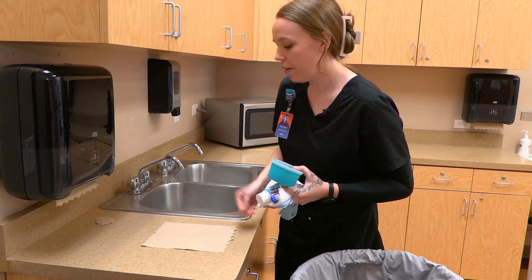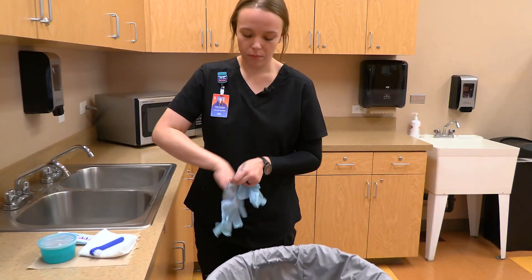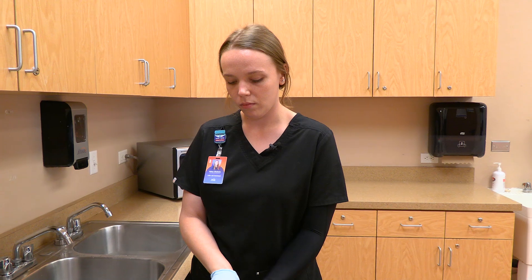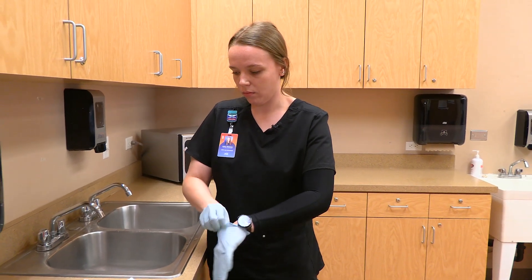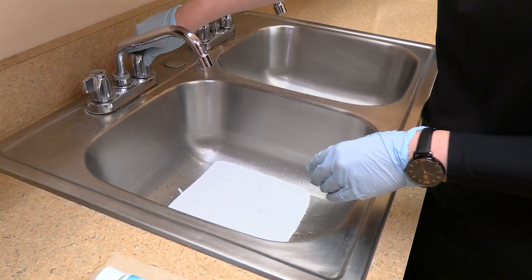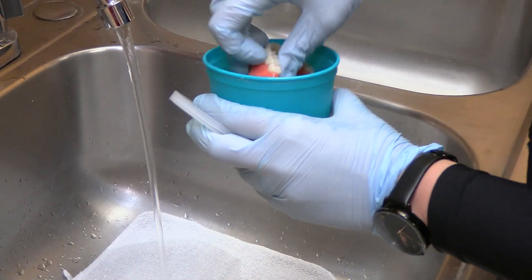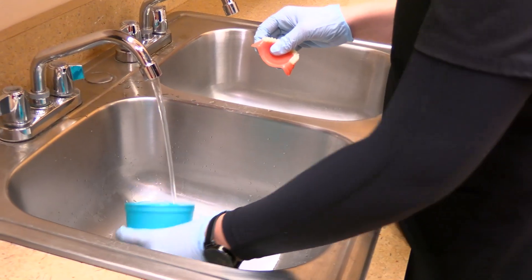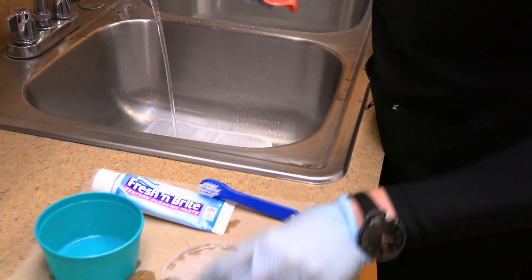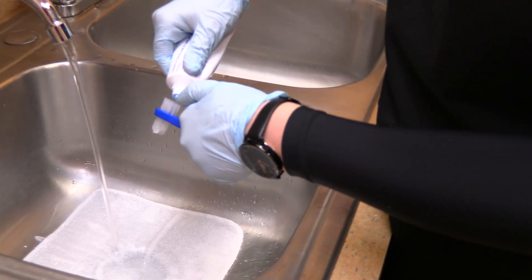I'm going to be laying a paper towel barrier down. I'm going to put my gloves on. I'm going to be laying a washcloth in the sink to prevent the dentures from getting damaged, and I'm going to only be using cool water. I'm going to dump the water out and rinse it. I'll put the denture cup on the barrier and rinse the lid. I'm going to wet my denture brush and put denture paste on.